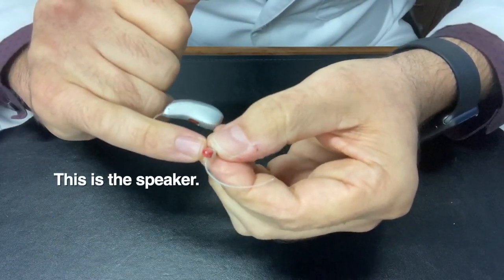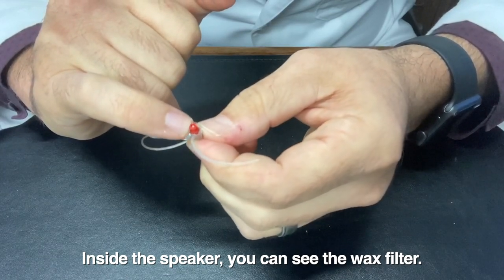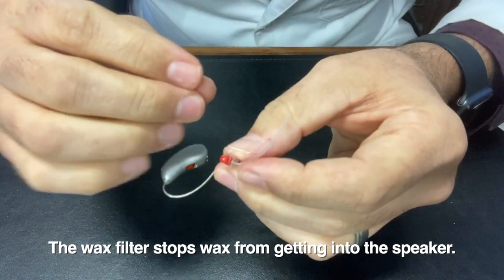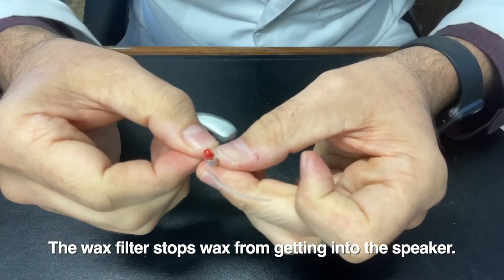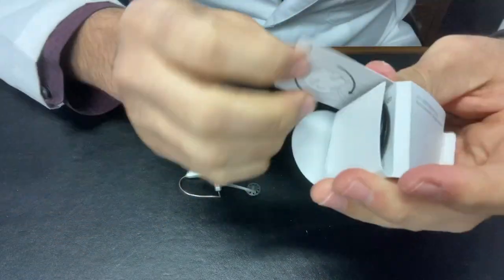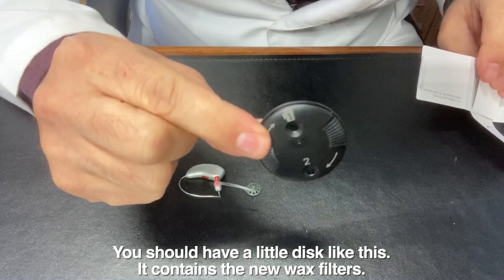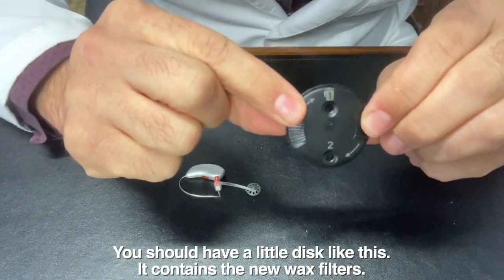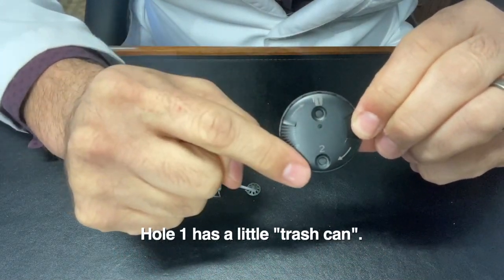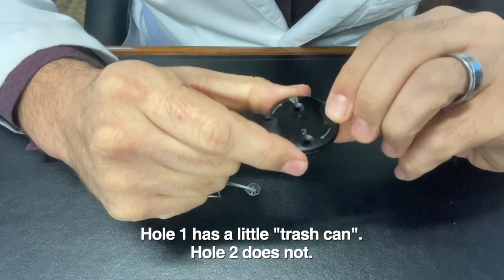This is the speaker, and inside the speaker there's what's called a wax filter. The wax filter is going to stop wax from getting into the speaker. The way that we remove it, you should be able to find a little disc like this. You can see that there's a one and a two — one has a little trash can and two does not.